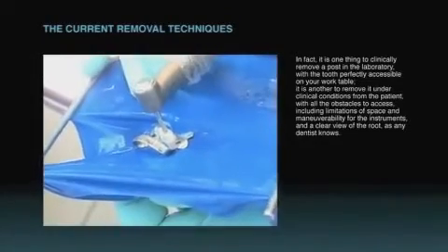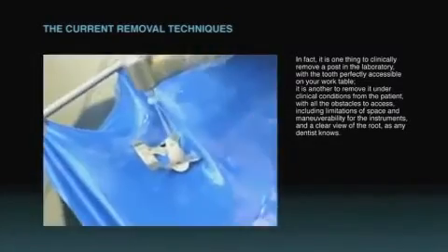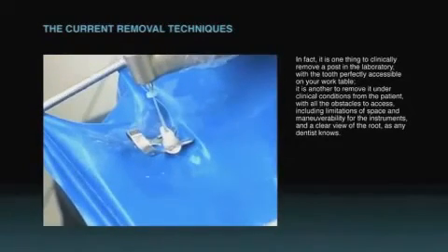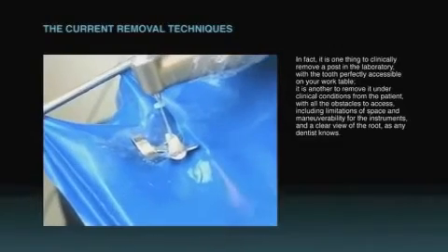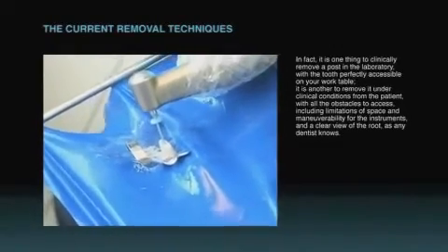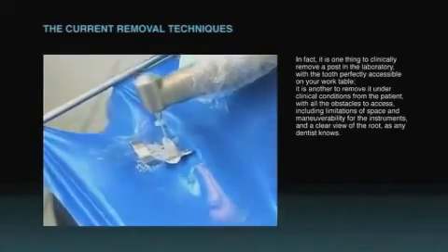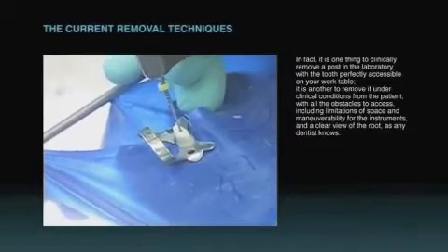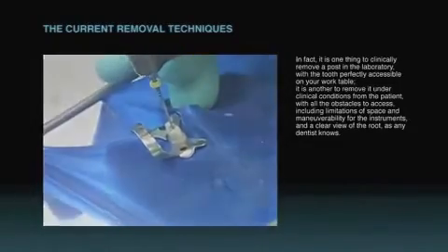In fact, it's one thing to remove a post in the laboratory with the tooth perfectly accessible on your work table. It's another to remove it under clinical conditions from the patient with all the obstacles to access, including limitations of space and maneuverability for the instruments, and a clear view of the root, as any dentist knows.